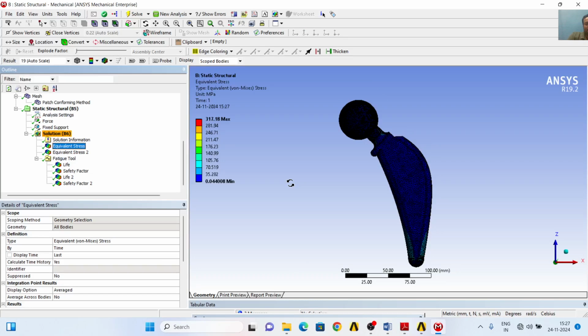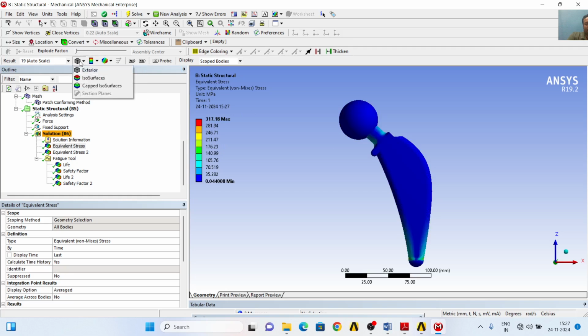So friends, we have now calculated the fatigue analysis and the mechanical investigation of the hip implant geometry, and you can see that the analysis has been done and it has taken around 10 minutes to complete, and now I will show you the solution of this investigation, and I will just set its behavior.